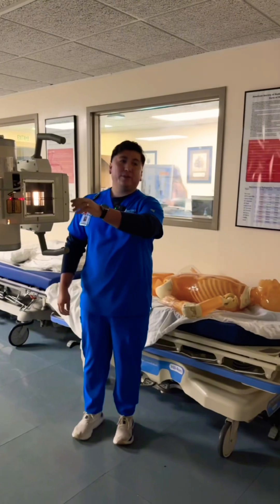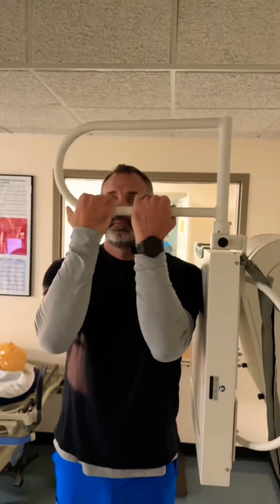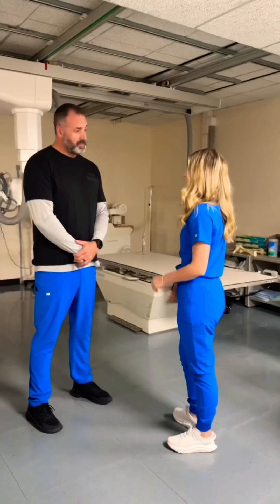Hey sir, you mind putting your left side up against that board for me and putting your arms on that bar? Okay, hold your breath.